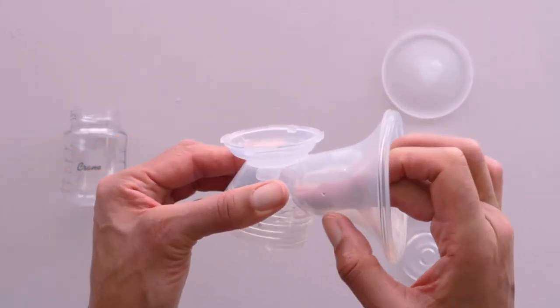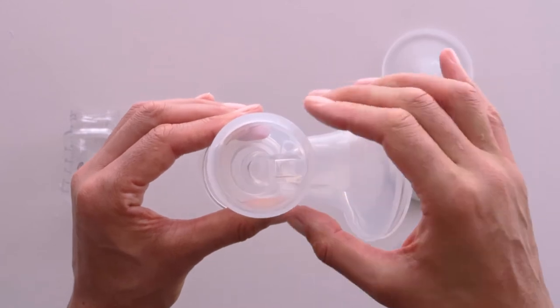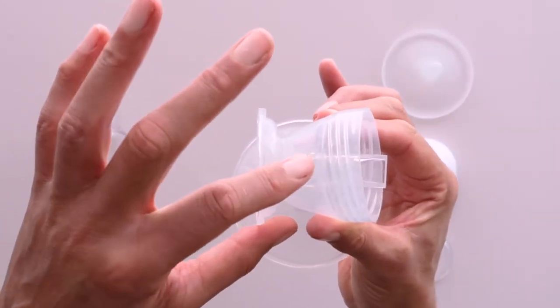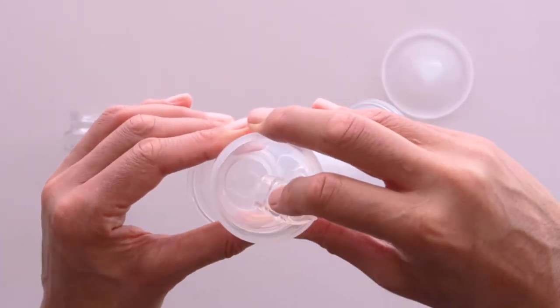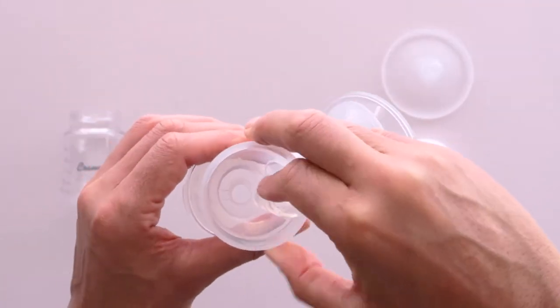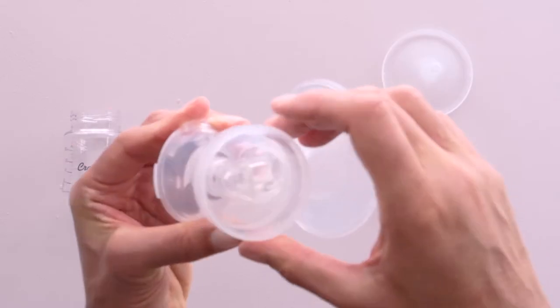Insert the silicon 3D cushion into the breast shield body. Secure the valve. Once the cushion is inserted into the breast shield body, gently push upwards on the valve to ensure it's securely attached.